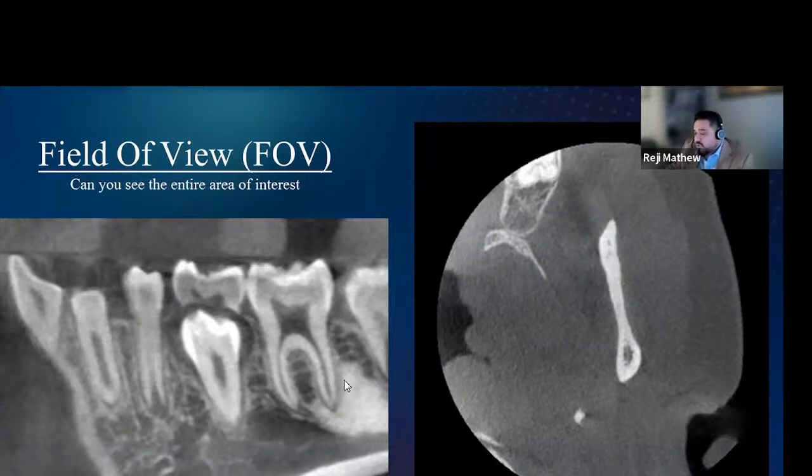Of course, if it's normal anatomy, of course not. But if you get part of a pathology, let's say that you took a maxillary sinus and you see the complete obliteration of the maxillary sinus in a small field of view, you are supposed to take a larger field of view and evaluate if the maxillary sinus ostium is intact, or if there is a drainage of the maxillary sinus ostium. So keep in mind, when you see a pathology, you are liable here, and I think the rules in India are also changing.